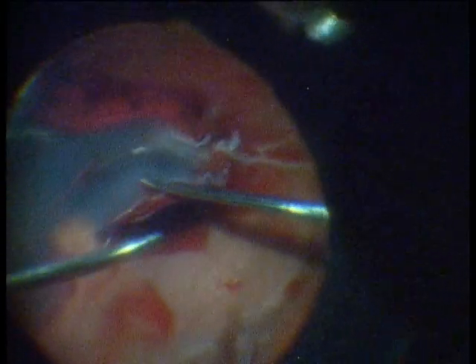I performed a phaco in this case because the patient needs extensive posterior segment surgery and a silicone oil injection, so an opacification of the lens could not be prevented.